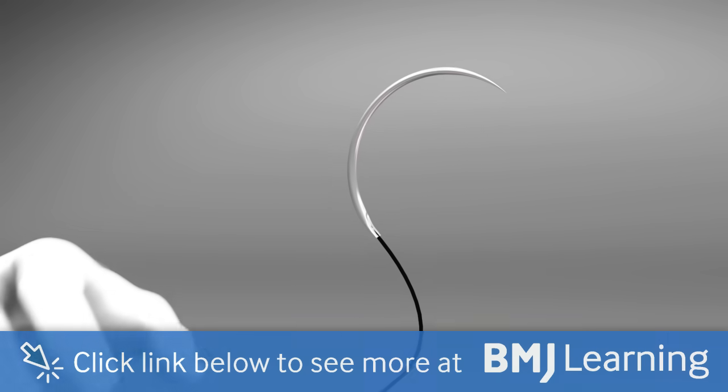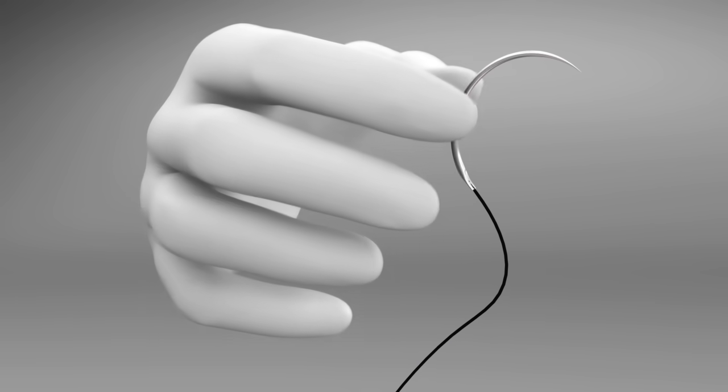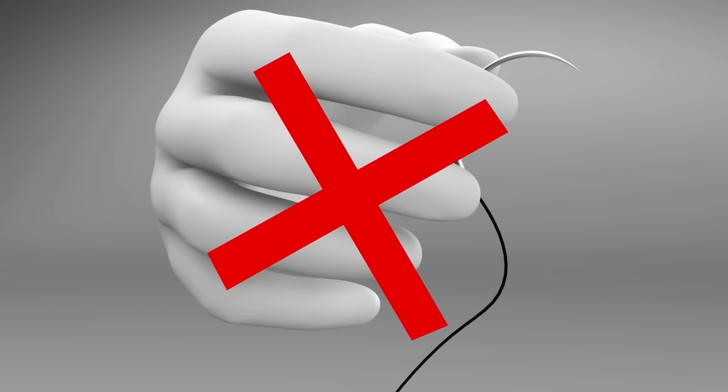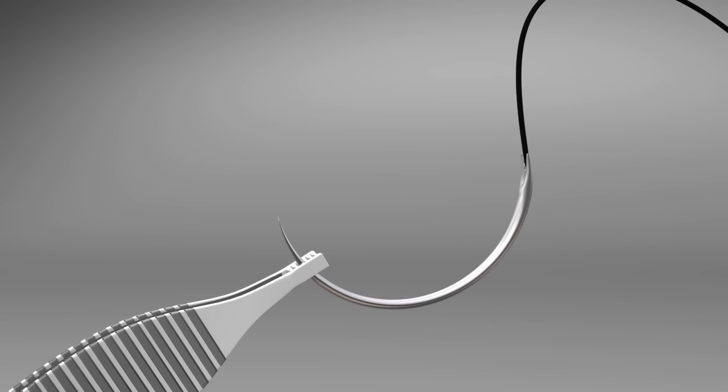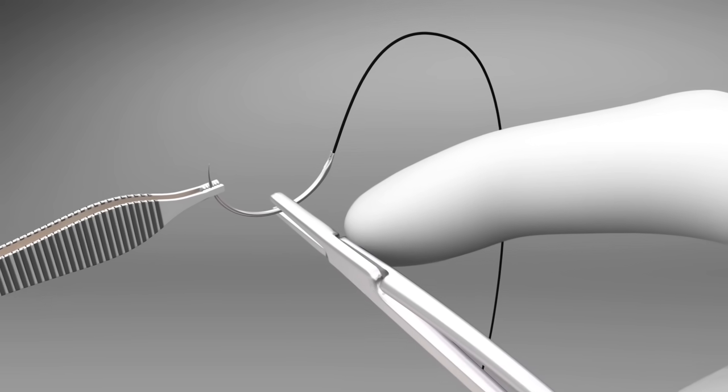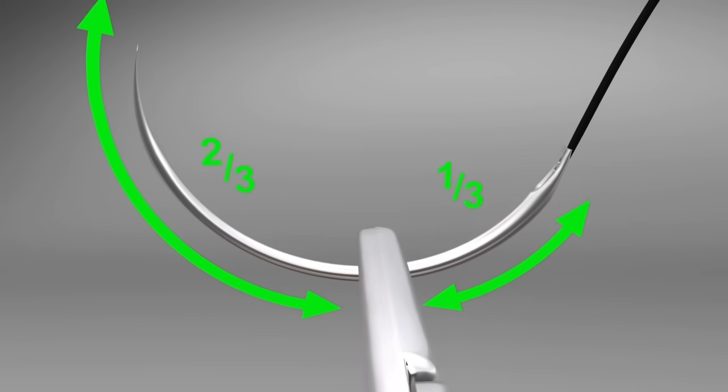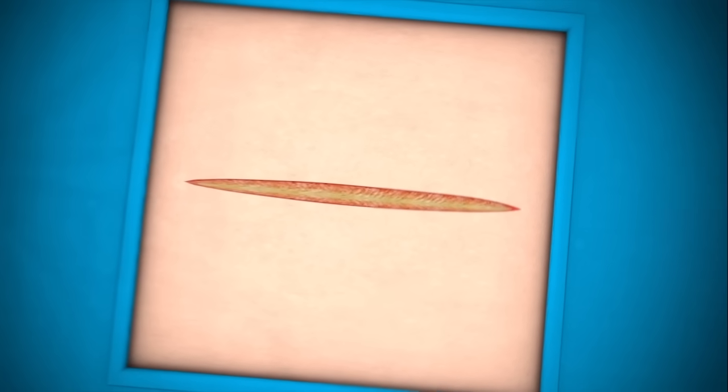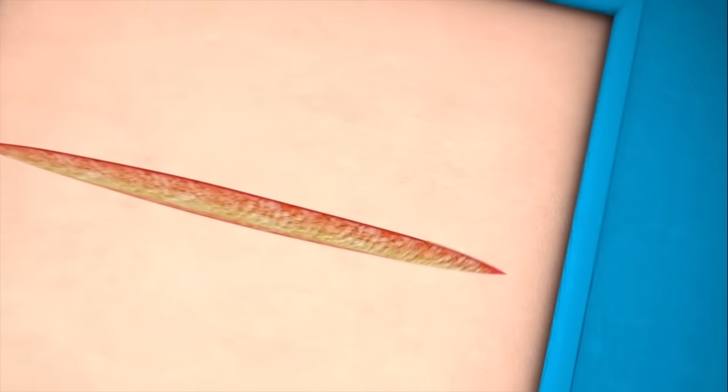Always use the instruments to pick up the needle and never use fingers risking a needle stick injury. Use the forceps to position the needle in the tips of the needle holder, grasping it approximately two-thirds along from the point of the needle. For small wounds, start suturing at one end of the incision.